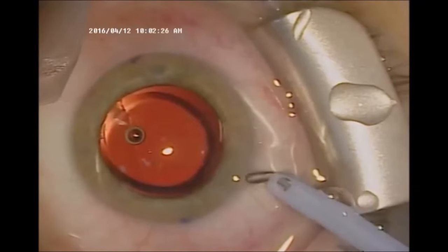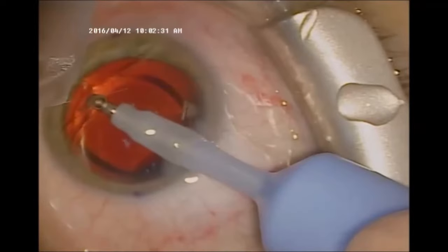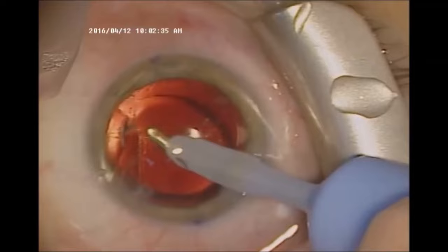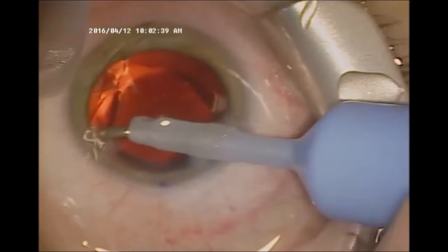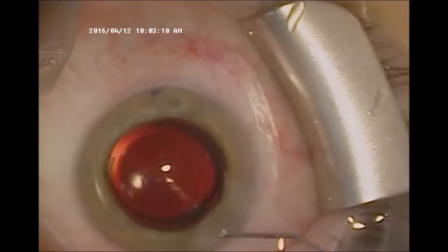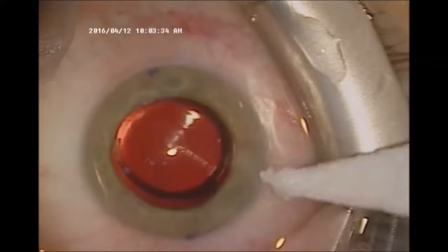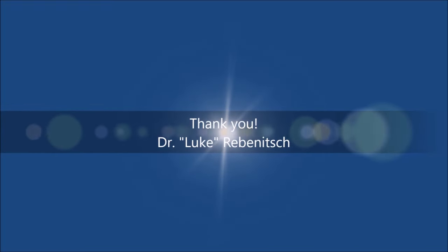Perfect. Then I use the irrigation and aspiration again in order to remove the viscoelastic material from the eye. And I also tap the lens in order to make sure that any material is removed from underneath the lens. And then hydrate the wounds, and they're self-sealing, and check the wounds to make sure that they're watertight.